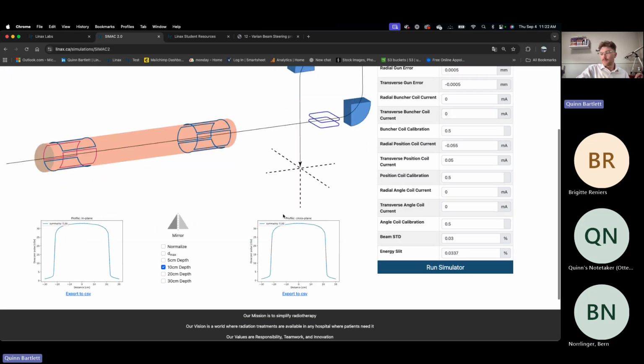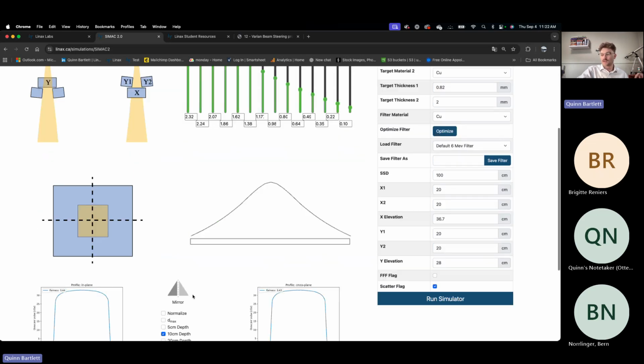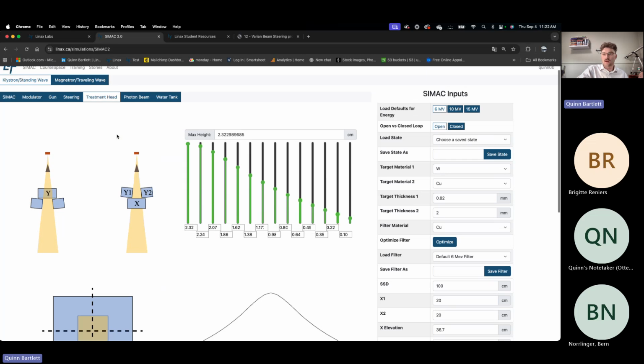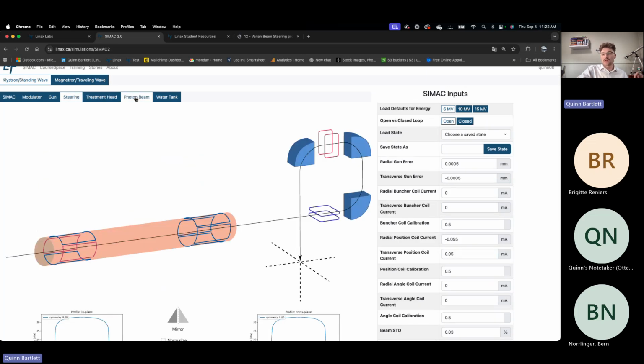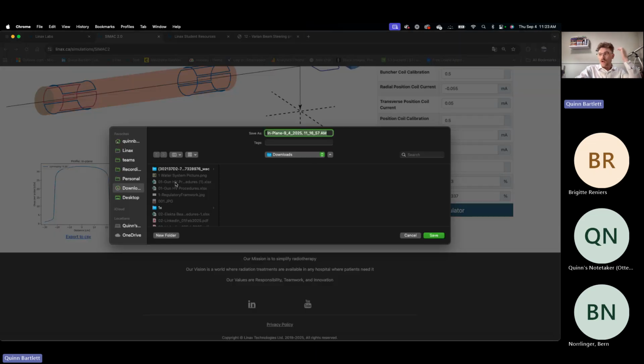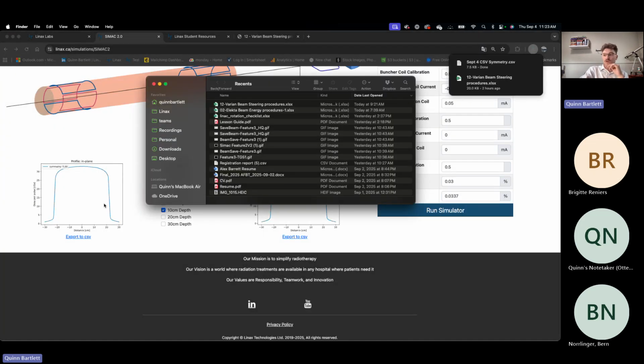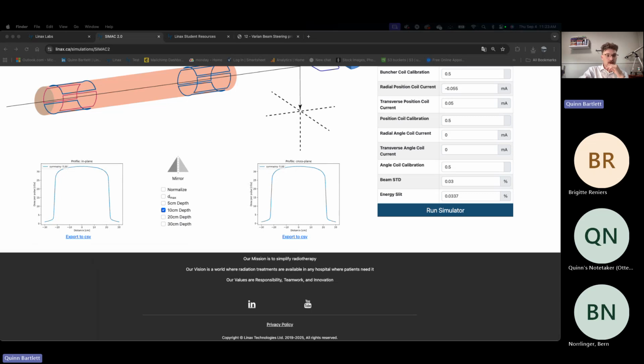Thank you. But on our water tank profiles, which are kind of the most important, which I would assume we'd want to export to do our own calculations, in our treatment head, in our steering, and in our photon beam, we have an export to CSV button right here under the graph, and then it just asks you to save it in a place. I'll just say symmetry, and then I'll show you what that looks like and what data gets saved for you.